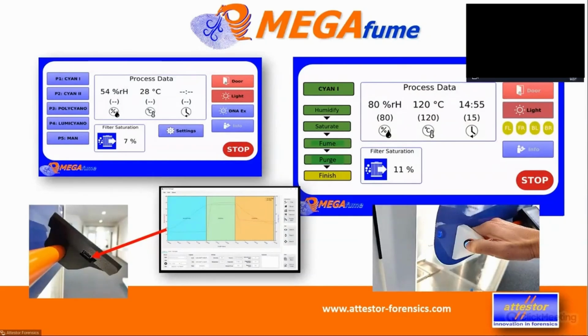You can see, probably not on that picture, but there will be graphs for the temperature and for the humidity, so you can actually monitor everything. You can give it a unique number for the cycle. You can type in comments, whatever. So this is kind of quality data, and quite nice for illustrating graphically what's going on there.